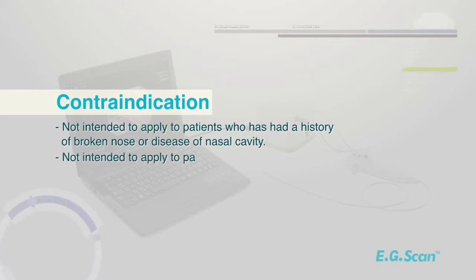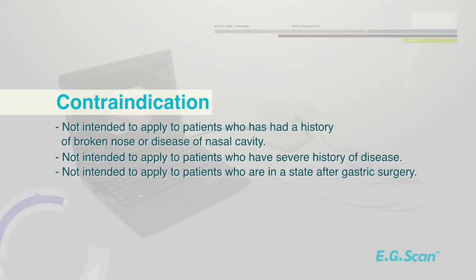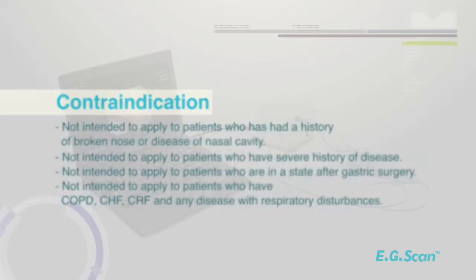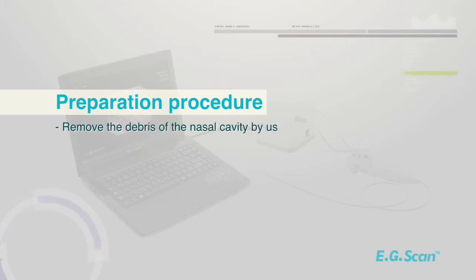Not intended to apply to patients who have severe history of disease. Not intended to apply to patients who are in a state after gastric surgery. Not intended to apply to patients who have COPD, CHF, CRF, and any disease with respiratory disturbances. Preparation procedure: remove the debris of the nasal cavity by using a cotton swab.